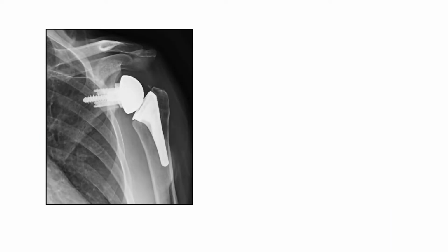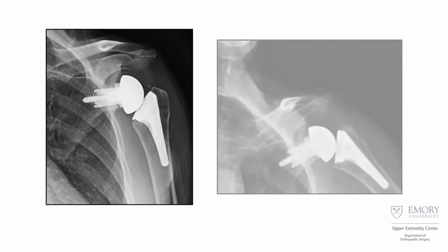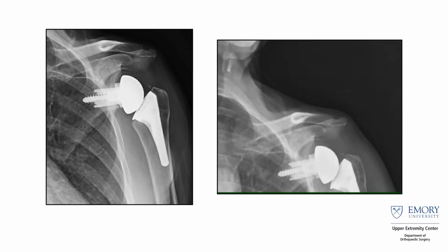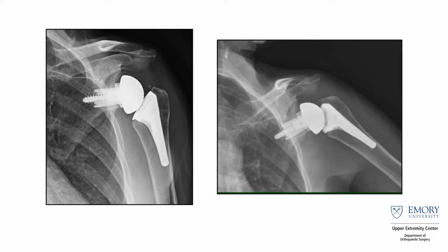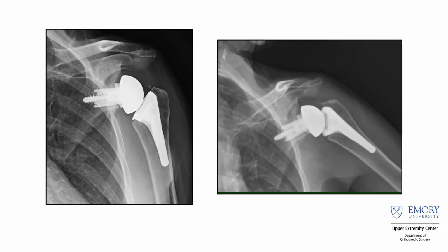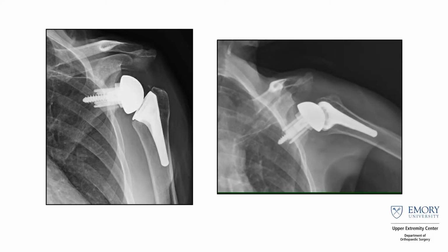But even more so, let's say you have a patient that you do a reverse on, and so you have this massive cuff tear, you do a reverse, it looks pretty good from my standpoint, but ultimately it's nice to know what's going on inside that reverse. So how much is their glenohumeral joint actually moving? How much is their scapulothoracic joint moving? How are they actually rotating? What's happening with the implant? Is there impingement on their acromion? Is there impingement inferiorly in adduction?